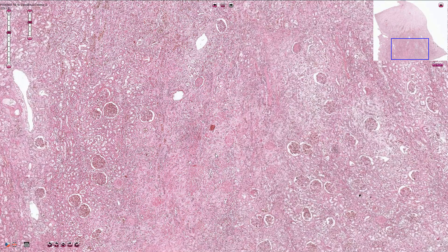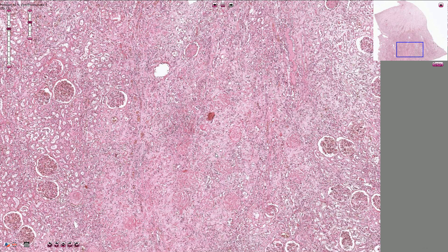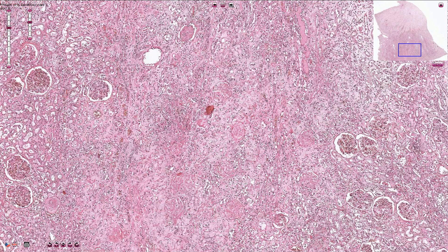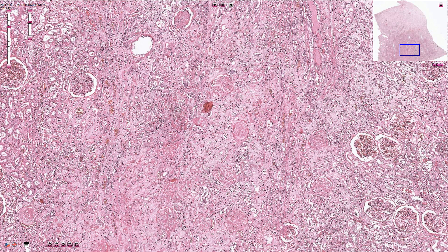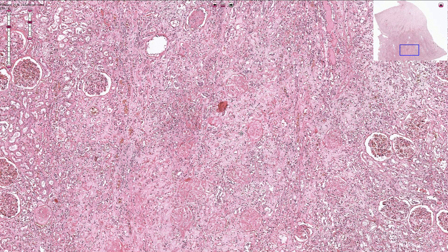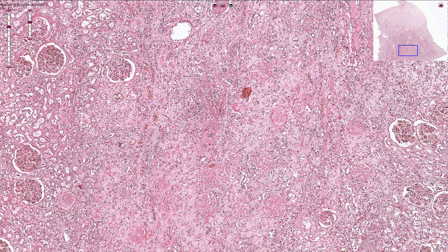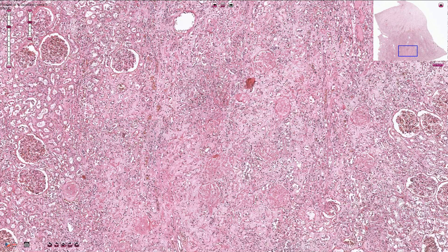Now let's go closer to see how the necrosis looks under the microscope. It is typically coagulation necrosis because of the high protein content of the renal parenchyma, and therefore we can still see the retained shapes of the cells but the nuclei are lost. That's because we have degeneration of the basophilic structures like DNA or RNA, which have a blue appearance in H&E staining.